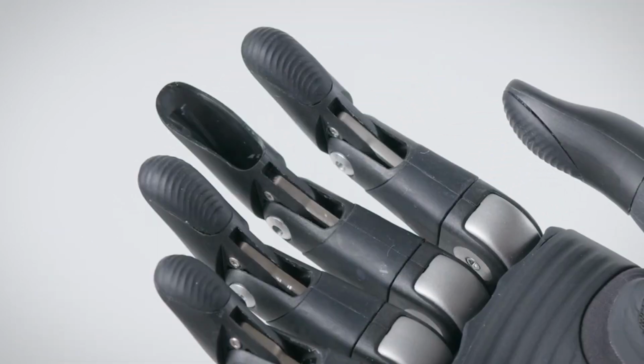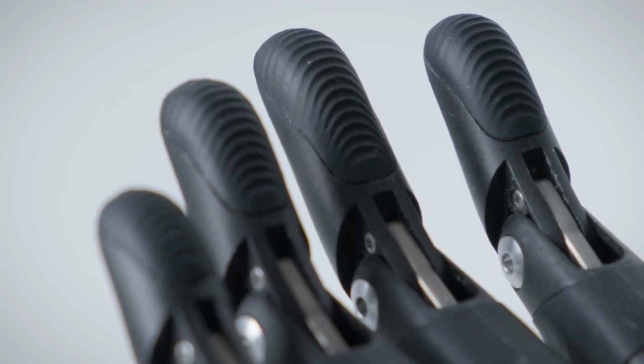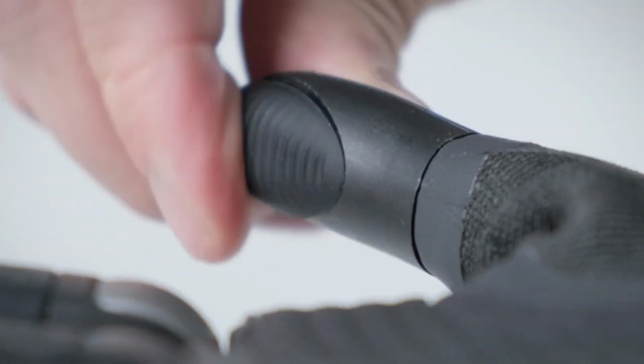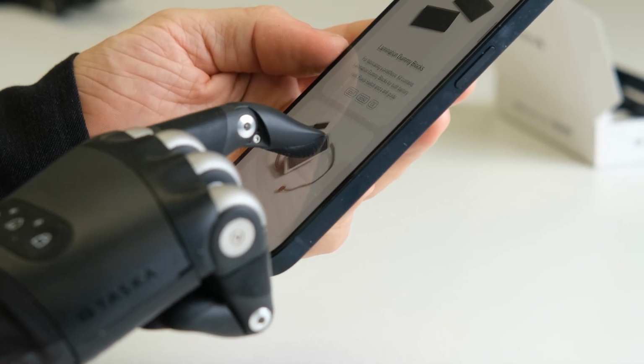To replace grip tips, slide the new tip from the top of the finger down until it clicks into place. For the thumb, first align the hook at the base of the grip tip, then press the top to click into place. All TASKA CX grip tips have capacitive touch, including the thumb, allowing users to operate any common touchscreen devices.